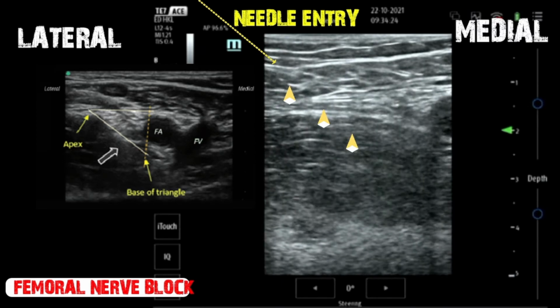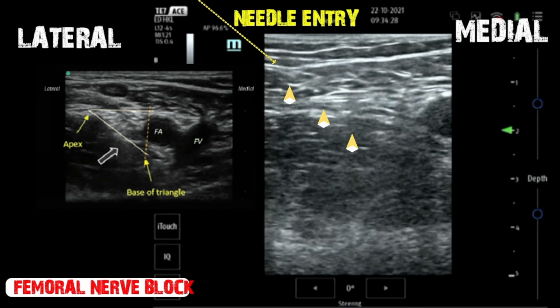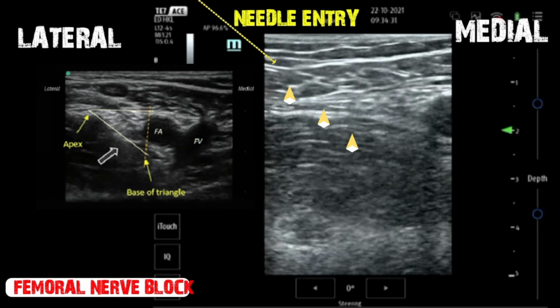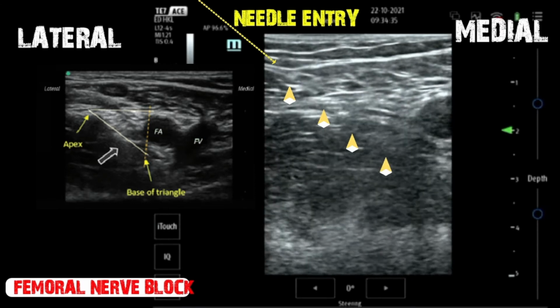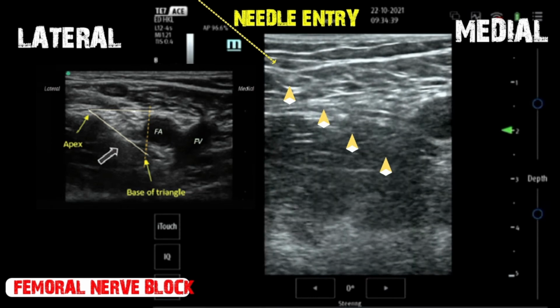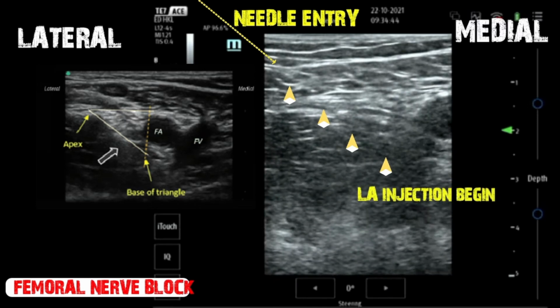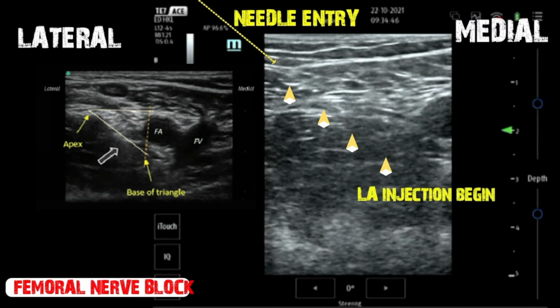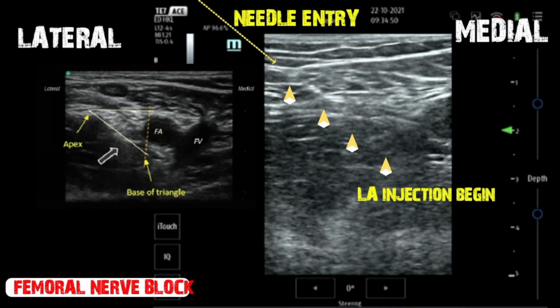We aim our needle to pass the posterior surface of femoral nerve so it subsequently becomes more superficial, creating a shallower skin to needle angle trajectory for the next needle pass anteriorly. Smaller angle of trajectory for second needle pass would enhance needle visibility.